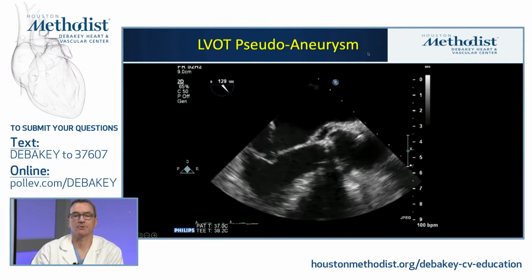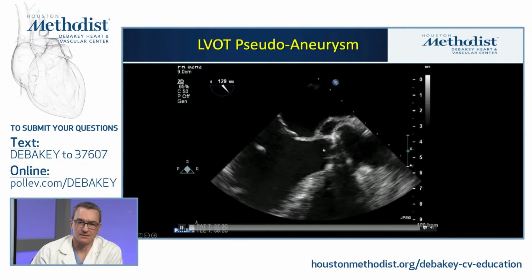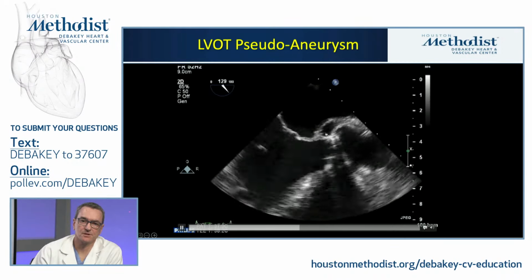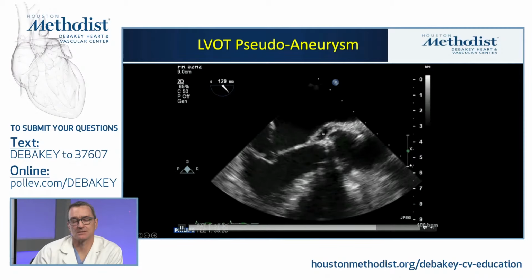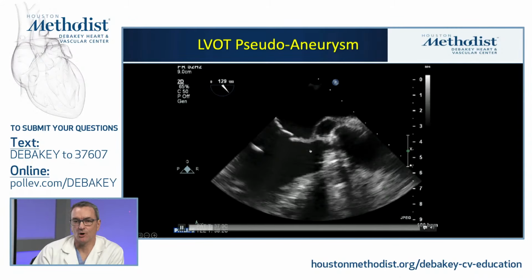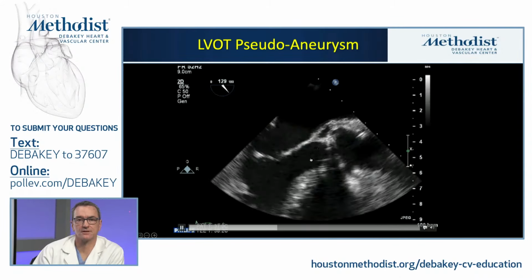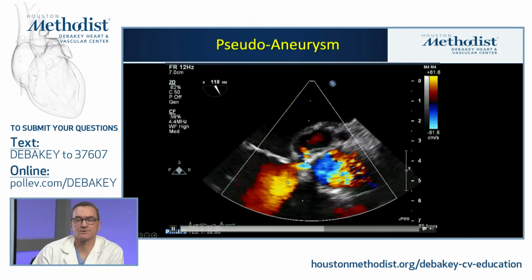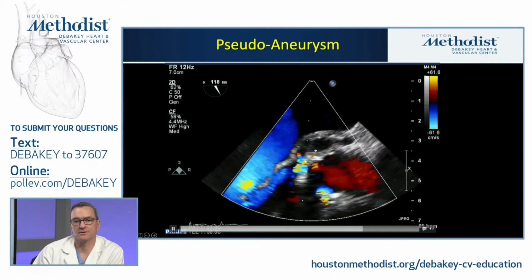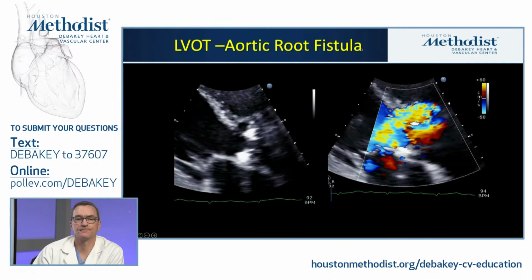This is really the natural history, what can happen. So once that pocket opens up at one end, blood is allowed to get in. It clears out some of the bacteria, but now you have a pulsatile mass. So whenever you have pulsatility to one of these collections, that means it must be open at one end. Typically it's the ventricular side, so that's a pseudoaneurysm. And the color Doppler demonstrates flow into and out of, and you could also show this with an M mode.